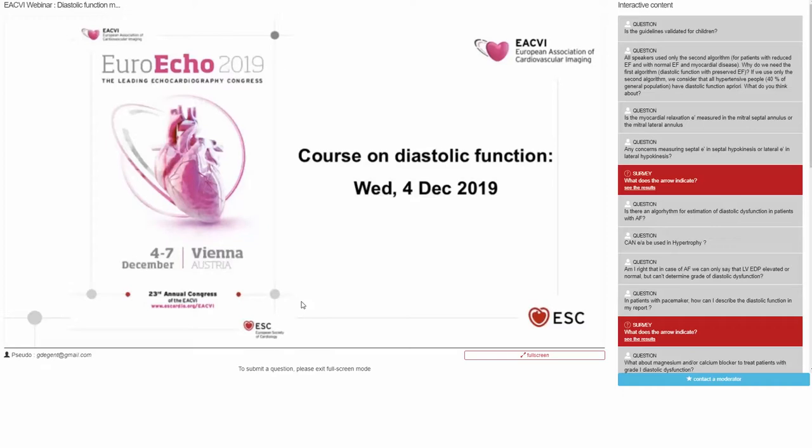Okay, I think I have another very good question, but would you like to make one comment there? Yeah, I think it's a very, very good discussion. If you go back to the revised proposal there, you can use exactly the same thing for atrial fibrillation, except for the E over E prime of 11 as a cutoff rather than 15 from the medial.